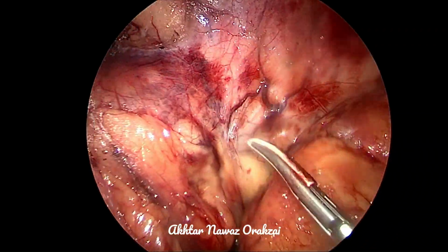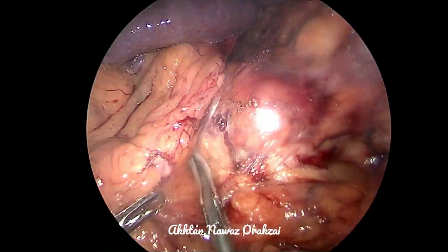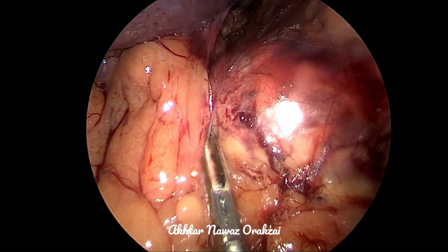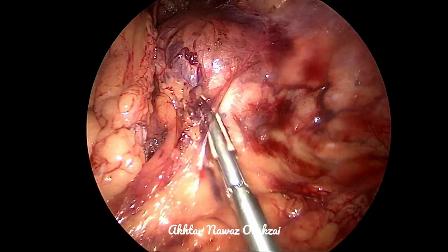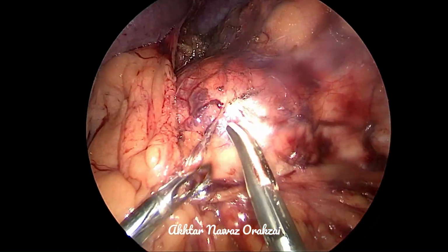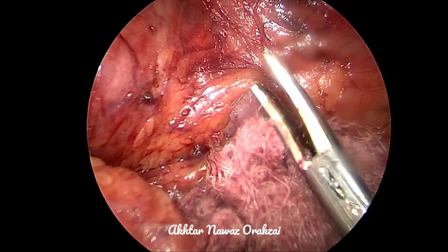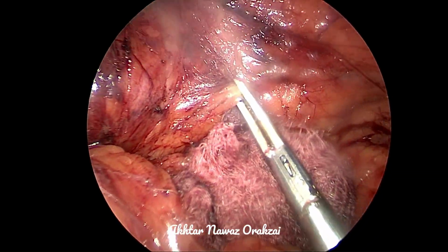So we have found the gonadal vein, and we have followed it, and by the location of the gonadal vein, we can now imagine where the renal vein would be. So the next step in doing an adrenalectomy on the left side is to identify the renal vein, and from the renal vein we will try to identify the adrenal vein.